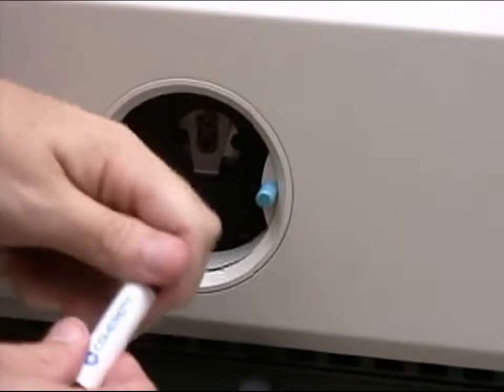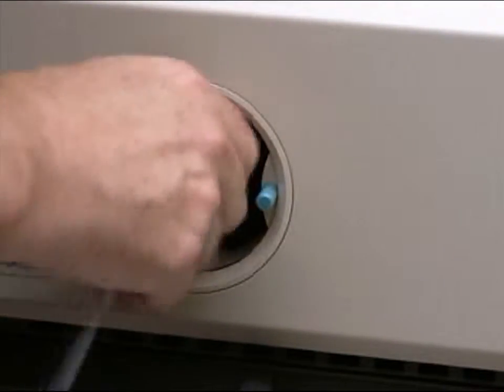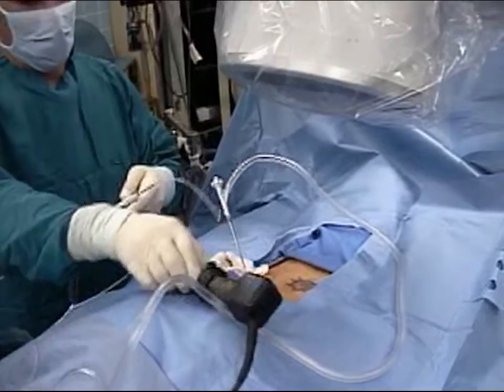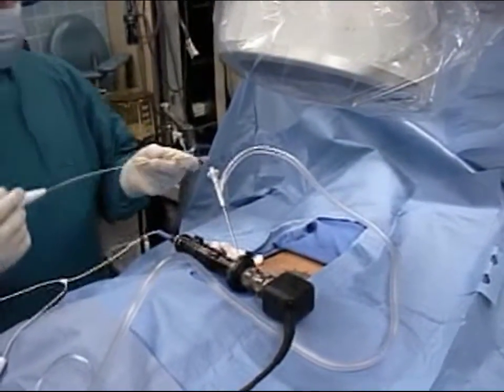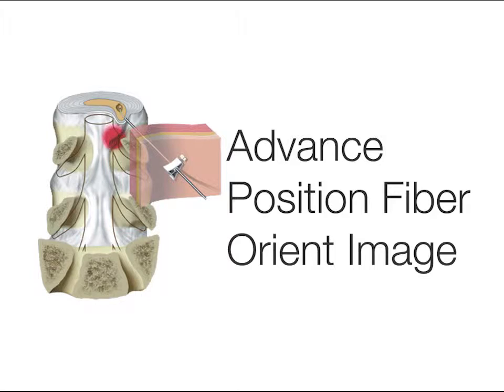Connect the laser fiber to the laser. Position the endoscope and slide it through the working channel. As you slide the endoscope through, you see the working channel walls, then the disc. The laser fiber is at the 9 o'clock position. Rotate the image connector to reposition it to the 3 o'clock position if you want up on the endoscope to correspond to up on the television monitor.